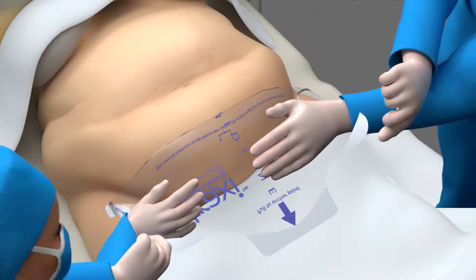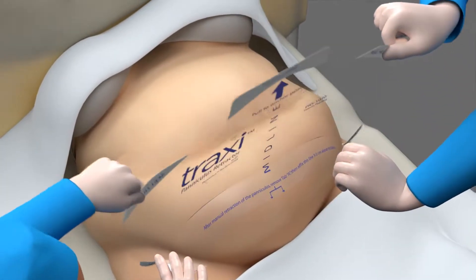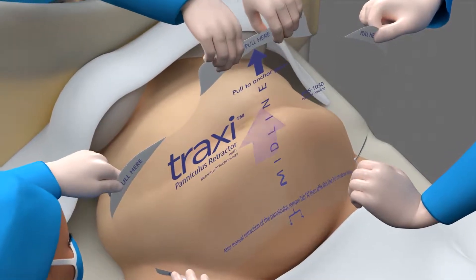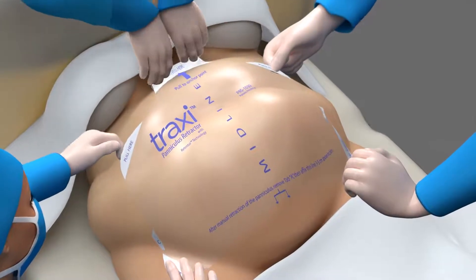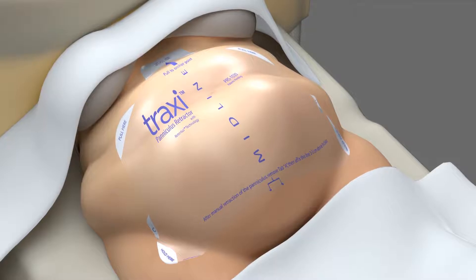Step 5: Using the Hold Here and Pull Here tabs together in unison, lift towards the ceiling and pull the retractor cephalad towards the head. When the desired retraction is obtained, apply Traxi to the patient's xiphoid or sternum. The retraction should now be optimal.